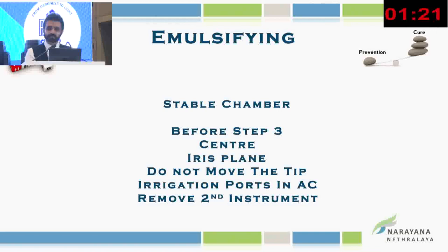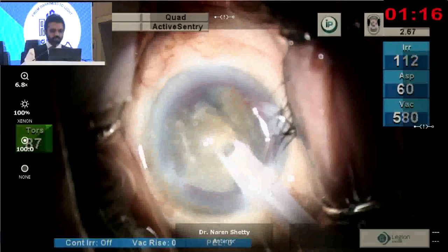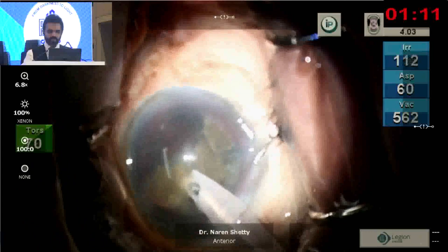So you can see here again, I bring it to the center, press 3, it disappears. Again, I bring it to the center, press 3, and I don't know if you have observed, I do not push and bring it to the center. It's almost a touch and the pieces come to me.